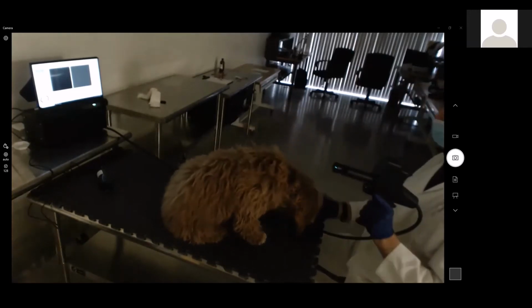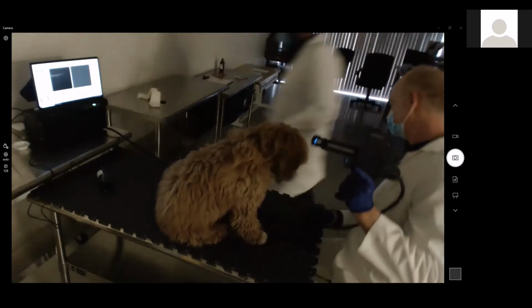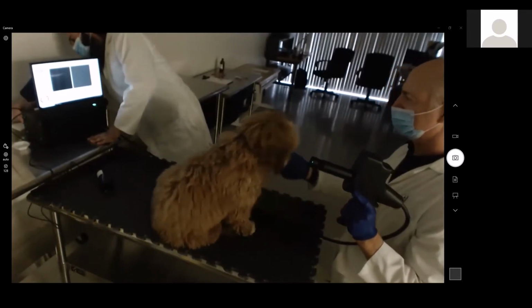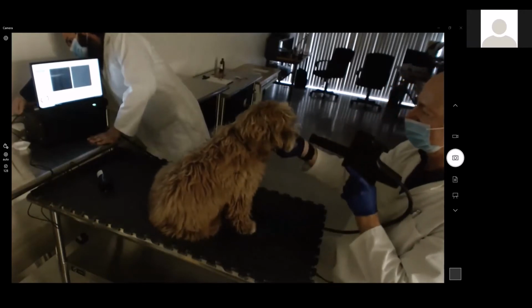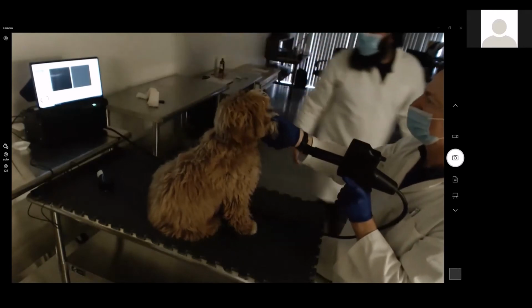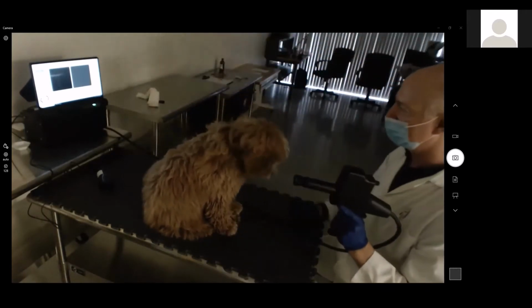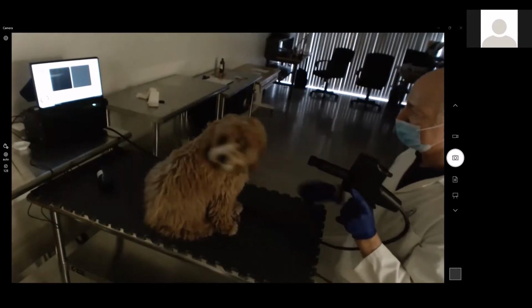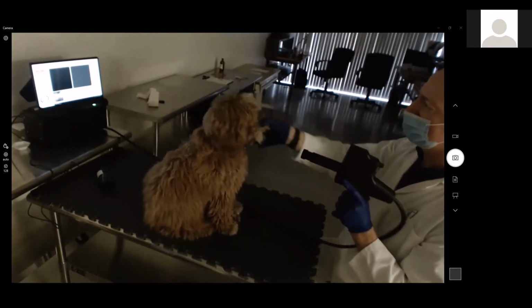I don't have a foot switch. One second. Are we unplugged? It must be. All right, we should have one. Okay, we'll just use the keystrokes from the place. All right, we're just going to skip that and go back to the mouse.